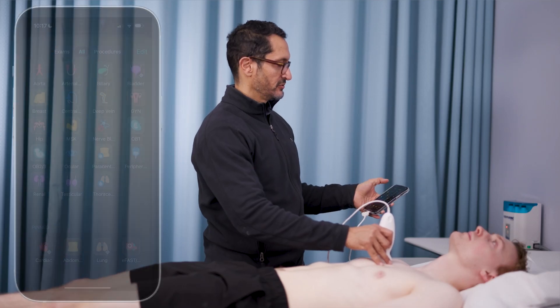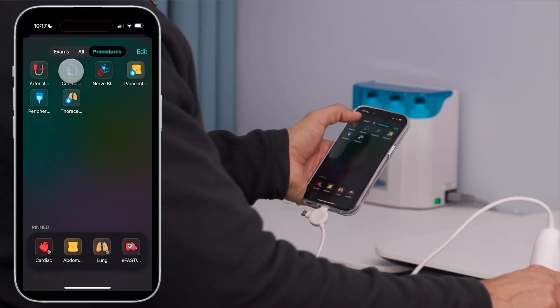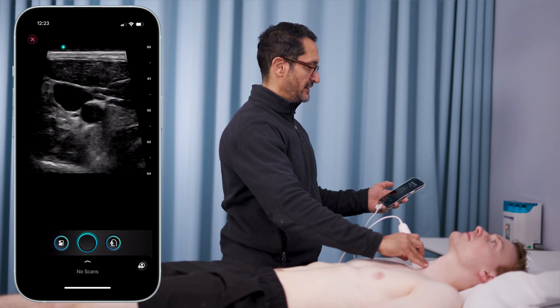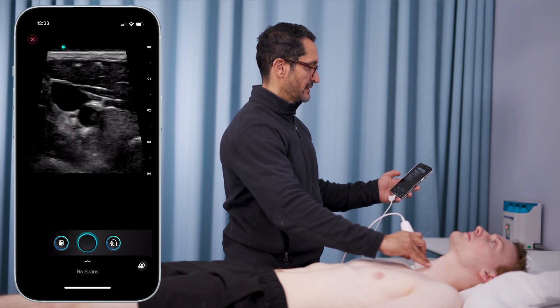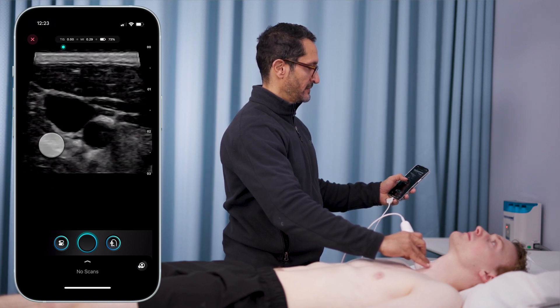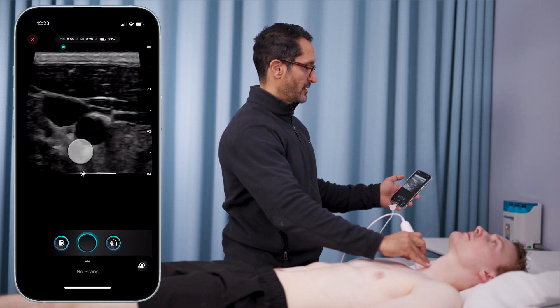I'll move on to central venous cannulation. I'm going to move on to procedures, hit the button, and go right up to his neck. You can see clearly nice views of both his IJ and his carotid — clearly visualized, clearly there. I'm changing my depth, changing my gain, and you can see clearly the IJ sits right on top of his carotid.